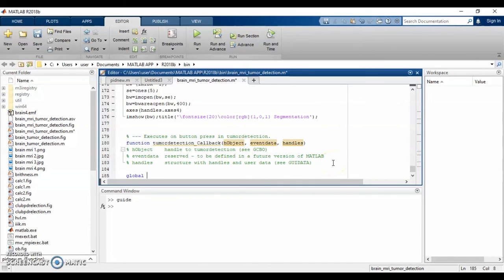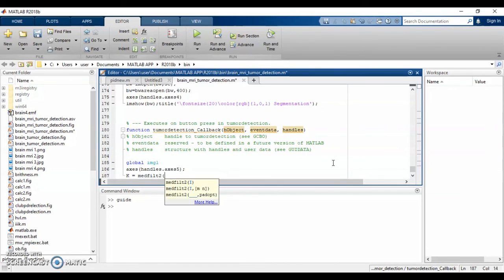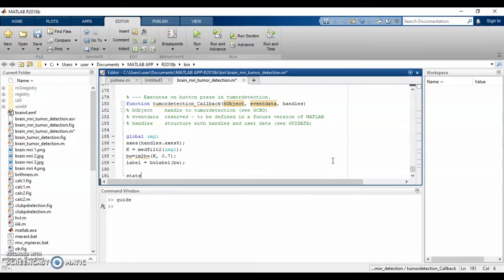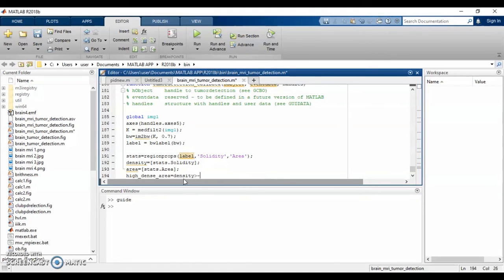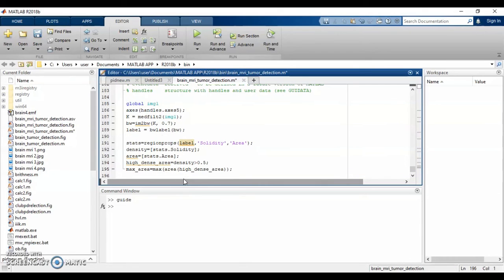So the last push button will be used for tumor detection. In this step, we need to convert the image into a binary image first by using the command im2bw. So in this project, we will use the thresholding technique for tumor detection, and the following is the script for thresholding. It will isolate the object of interest from the background, which is the brain tumor in this case. But first, we will need to create a script to define the tumor. In our project, any pixel with density greater than 0.5 will be considered a high dense area, and it will probably be the tumor.